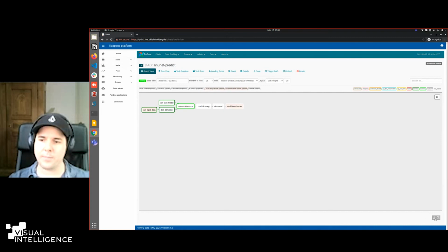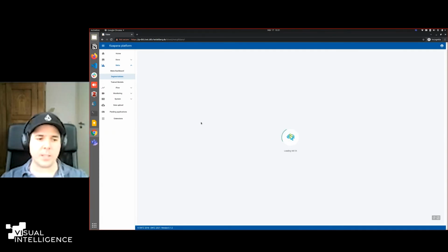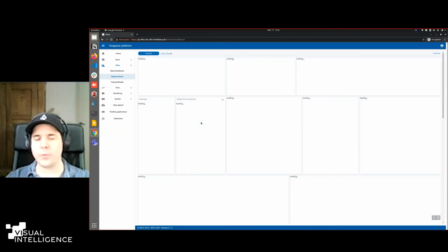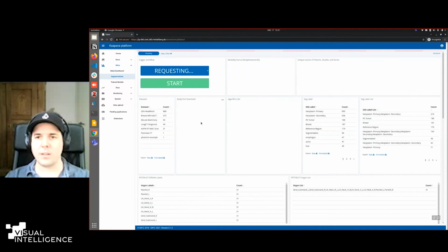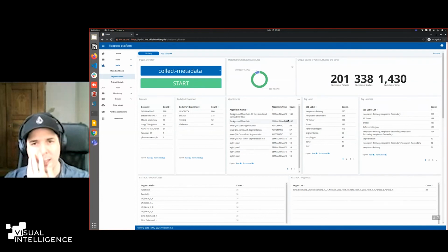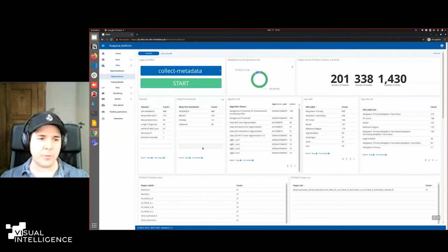So when that's completed, like we already have a couple in there. We also have a second dashboard here, which is specialized on segmentation. So we see different aspects of the ground truth of available data on the system. In this case, we have quite a lot of segmentations already in the system. It right now supports RT-Struct and DICOM segmentations. And for example, if you want to train a model, that would be the view where I'm searching my ground truth data set.